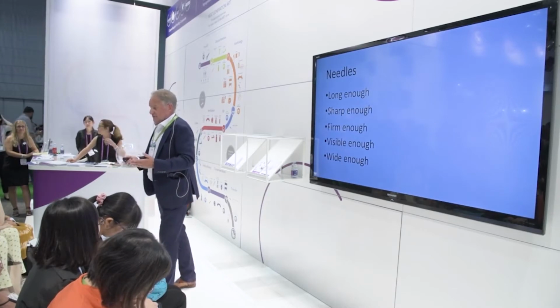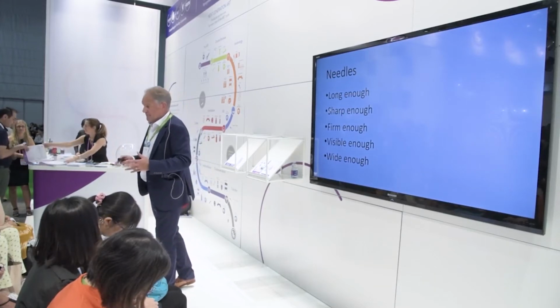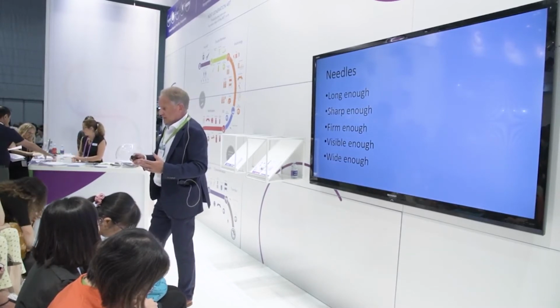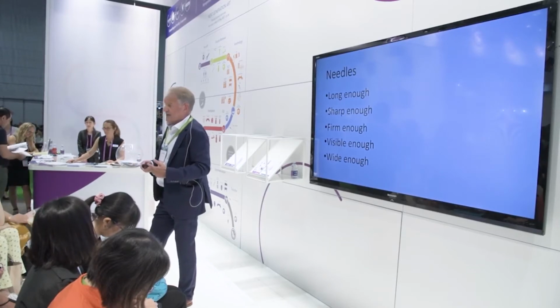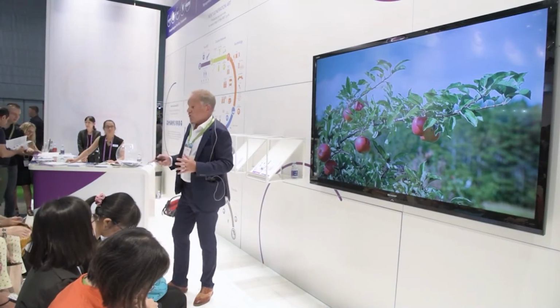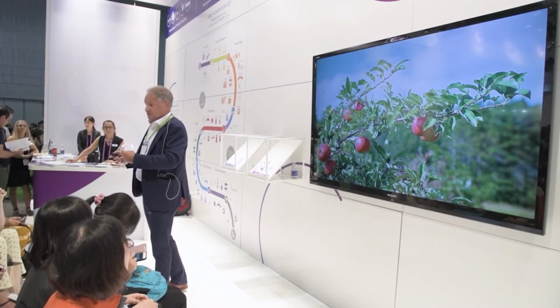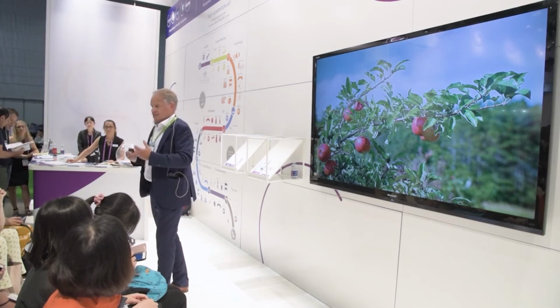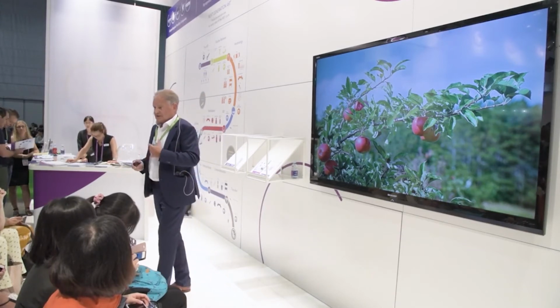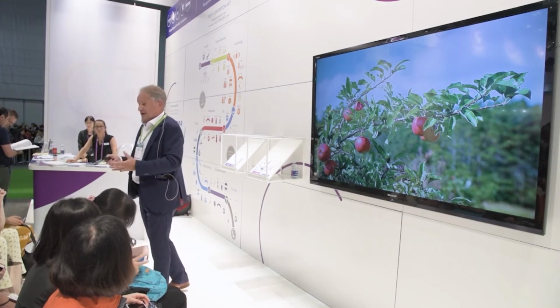In the NICE guidelines that are published in the United Kingdom every 5 years, we also do not recommend that flushing should be a routine procedure. I know a lot of clinics still offer flushing as a way to optimize the number of eggs that you get. But nowadays, now that we can control ovarian stimulation and we don't have to go for immature eggs because of the risk of ovulation, we can grow those follicles a little bit larger, not too large, because we don't want the eggs to be post-mature, because our embryology colleagues tell me now, do not give me a post-mature egg because I won't be able to fertilize and biopsy it as well.